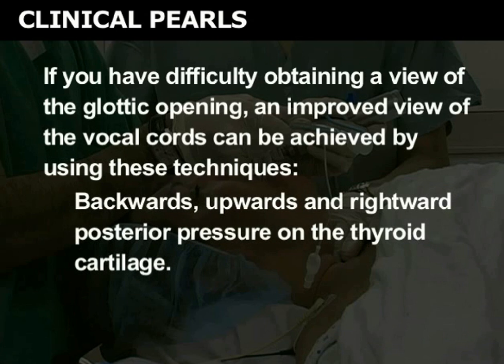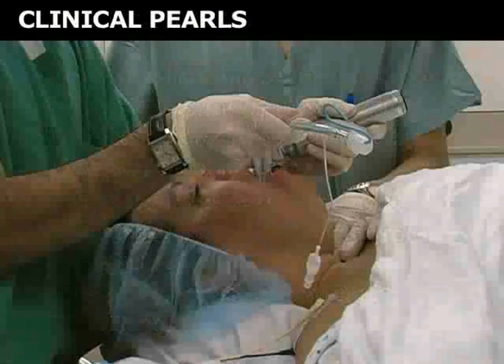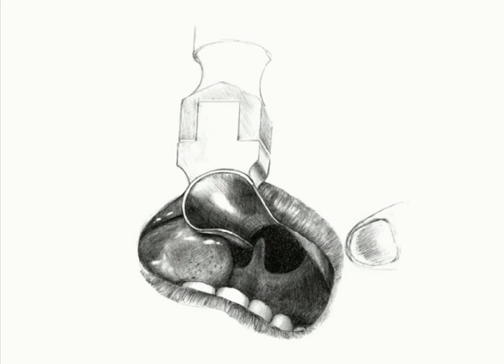Exert backward, upward, and rightward posterior pressure on the thyroid cartilage. Exert posterior pressure on the cricoid cartilage. By placing 30 newtons or less of posterior pressure on the cricoid cartilage, the glottic opening will move into your line of view, enabling you to better visualize the vocal cords. Unlike the location of the Macintosh blade, the Miller blade tip sits under the epiglottis. Here, the epiglottis is not visualized. Only the glottic opening is seen.